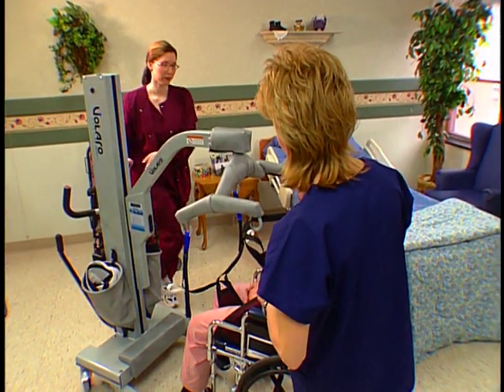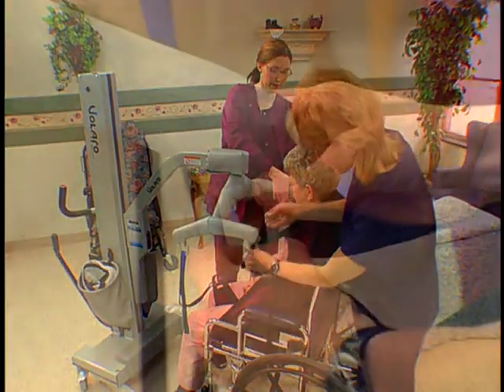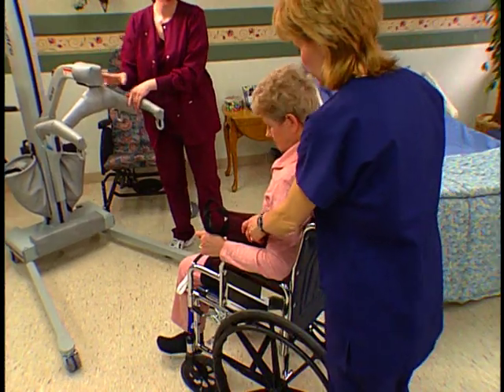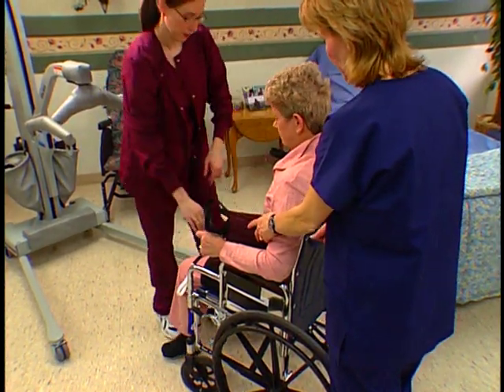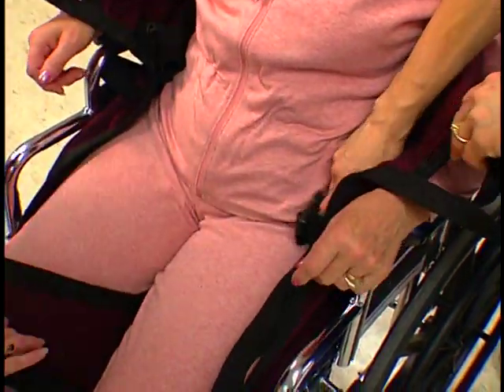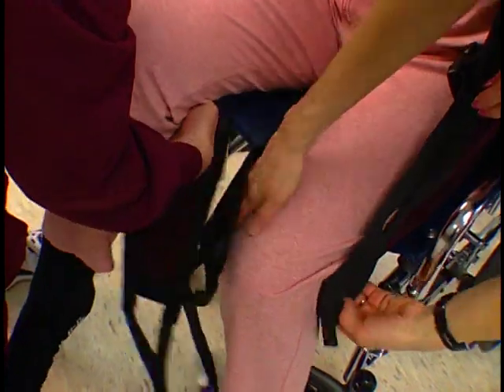Lower the hanger bar until there is enough slack in the sling straps to unhook them from the J-hook. You may now unhook the straps and push the lift away. To remove the sling, stand in front of the person and uncross the leg straps. Now lift one leg and start removing the material from the underside.